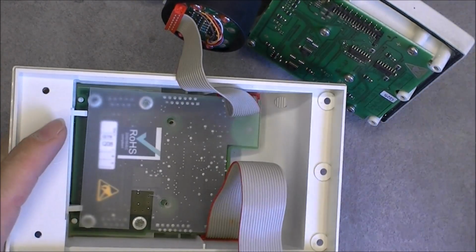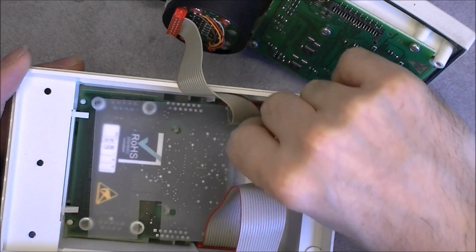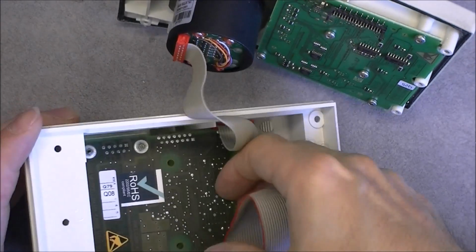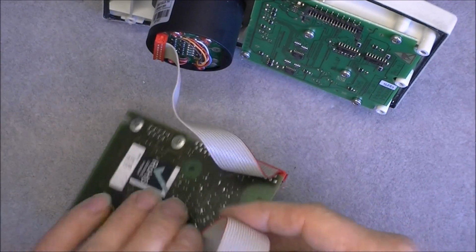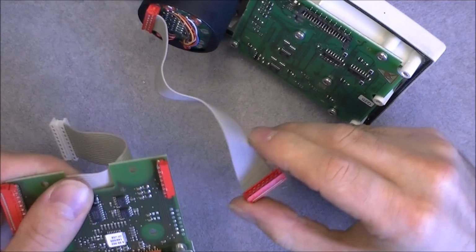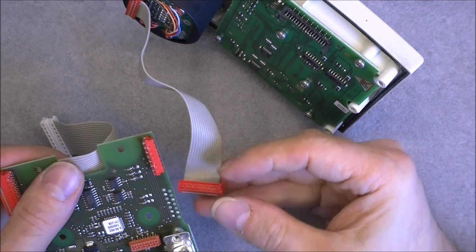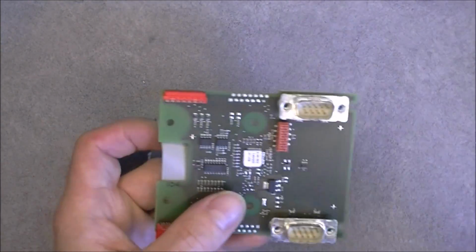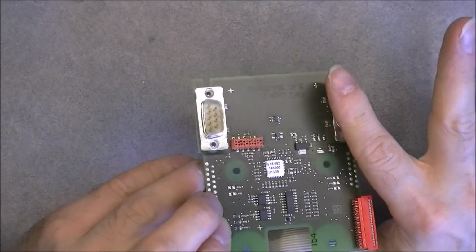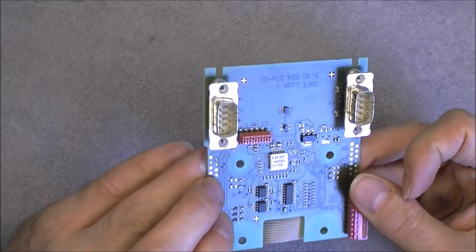So as you can see, we have no shielding. This is just a plastic part of the case. Some insulator sheet here, and here we are. So these connectors, by the way, seem very delicate. So we will start with this PCB. I had a quick look into the other controllers, and we don't have the same thing on the PCBs.